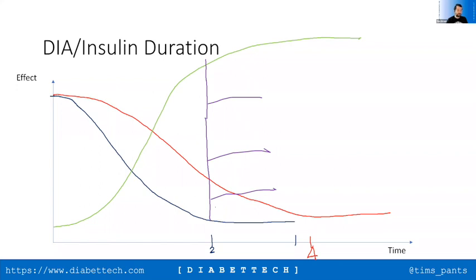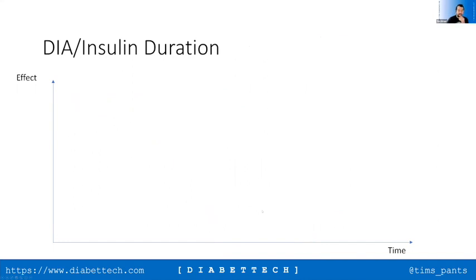because otherwise I end up with it overdosing insulin in the tail. And that's really why we set our duration of insulin action to 5 hours or longer, because actually there's quite a long tail on all of these supposedly rapid acting insulins. They're not very fast on and they're even slower off. And that's the key thing about it here. So that's why we set our duration of insulin action to the level that we set it at. So hopefully people understand that.